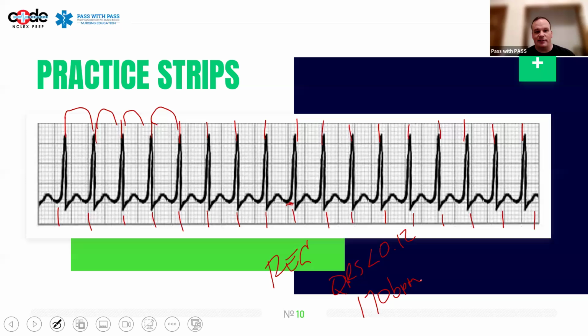Okay. So I can't say, yeah, I think this is sinus tach, or I think it's junctional tach, or man, it might be an A flutter. I don't know. It doesn't matter. It's fast, meaning it's more than 150 beats a minute. It's narrow complex and it is regular. Therefore, we term it a supraventricular tachycardic rhythm or an SVT rhythm.